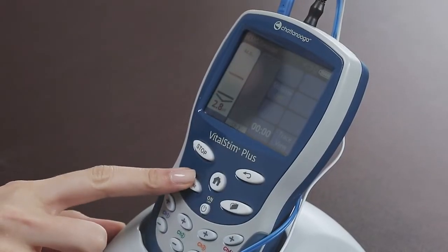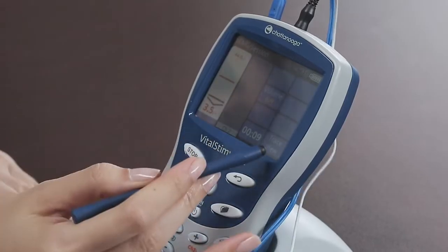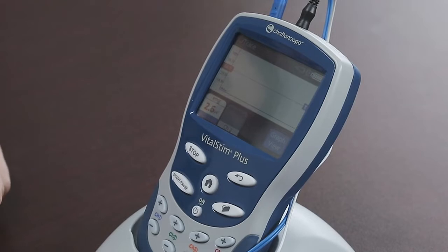Press start pause to start recording the session data and ask the patient to contract in such a way as to exceed the threshold. You can do this in this graph view, or you can switch to trace view, which tends to be easier for the patient to work with.